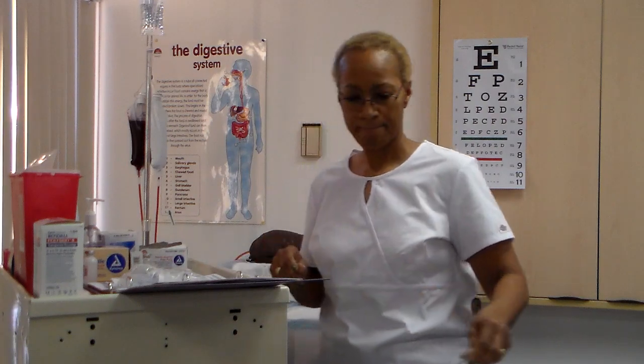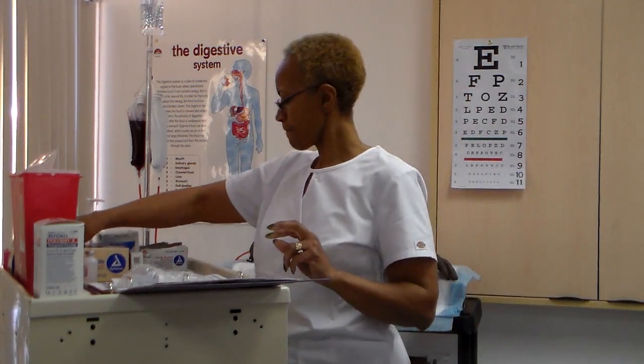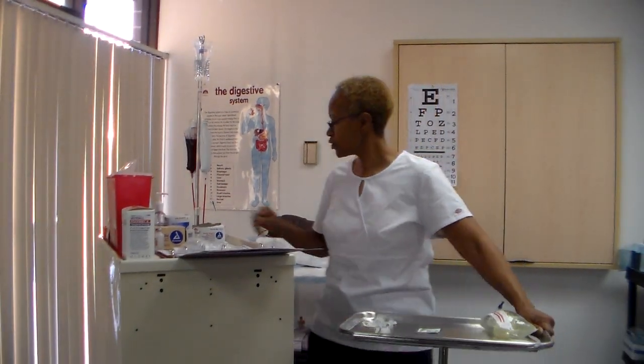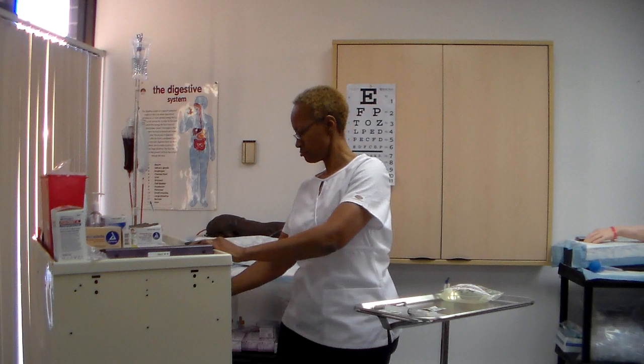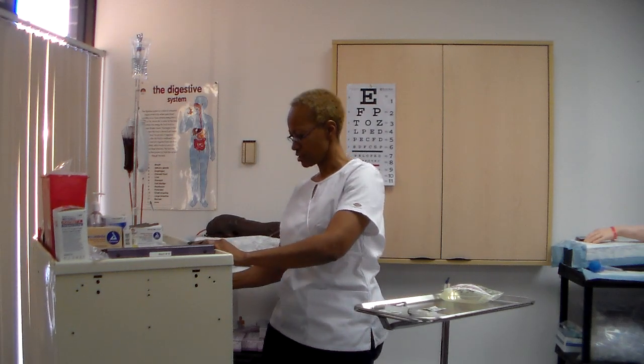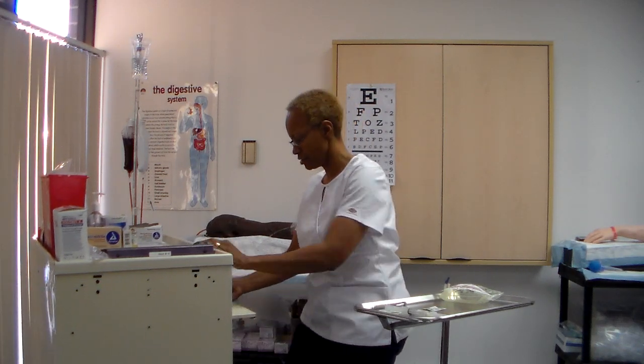Bring assembled items to client's bedside at right time and perform hand hygiene. So I'm going into my client's room. I'm going to, of course, close my MAR, lock my cart.